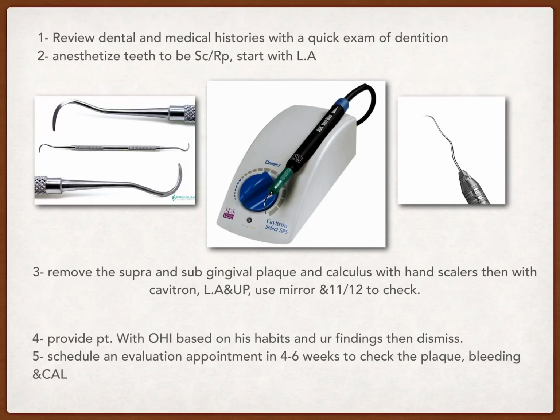After doing that, you should check your work, and that is by the use of a mirror and the 11/12 probe.